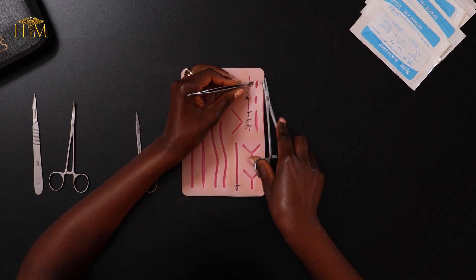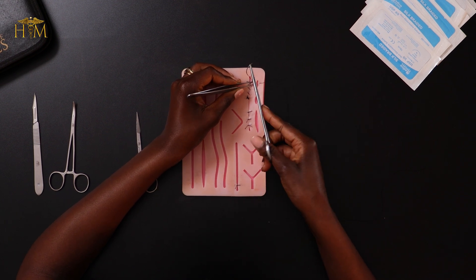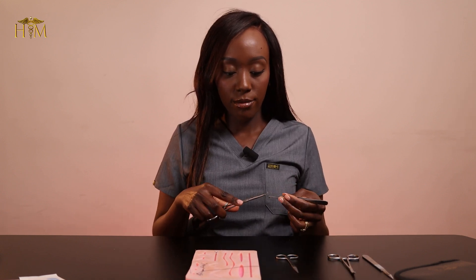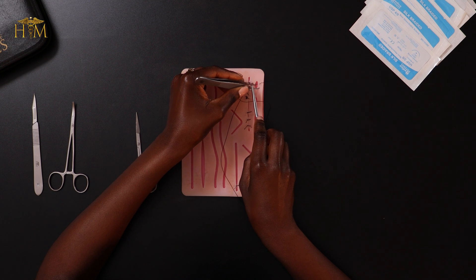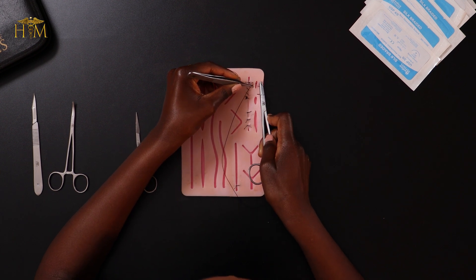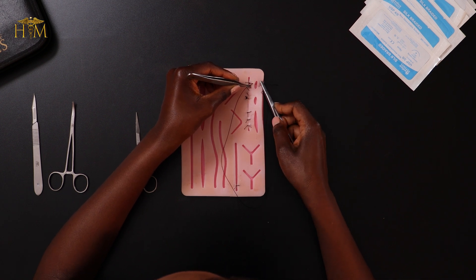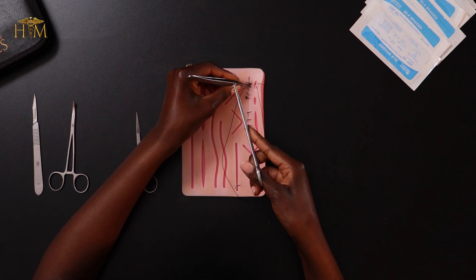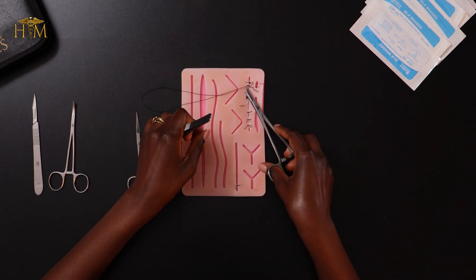I advance my needle until it comes all the way out, leaving a few centimeters of suture on the other side. Then I reposition my needle and go back in on the opposite side to where the suture is — which is the same side as where I started — again a few millimeters away from the edge of the wound. I advance my needle until it comes out the other side, then pull the suture through.